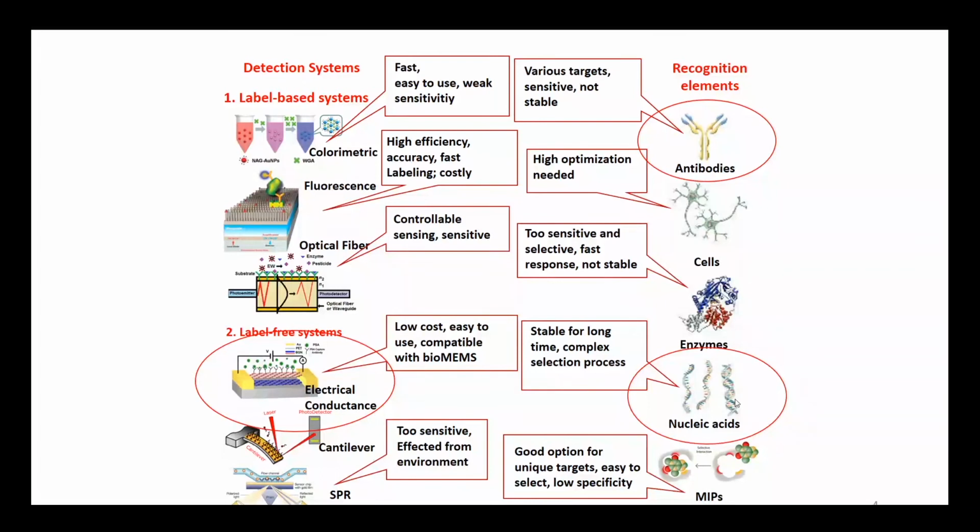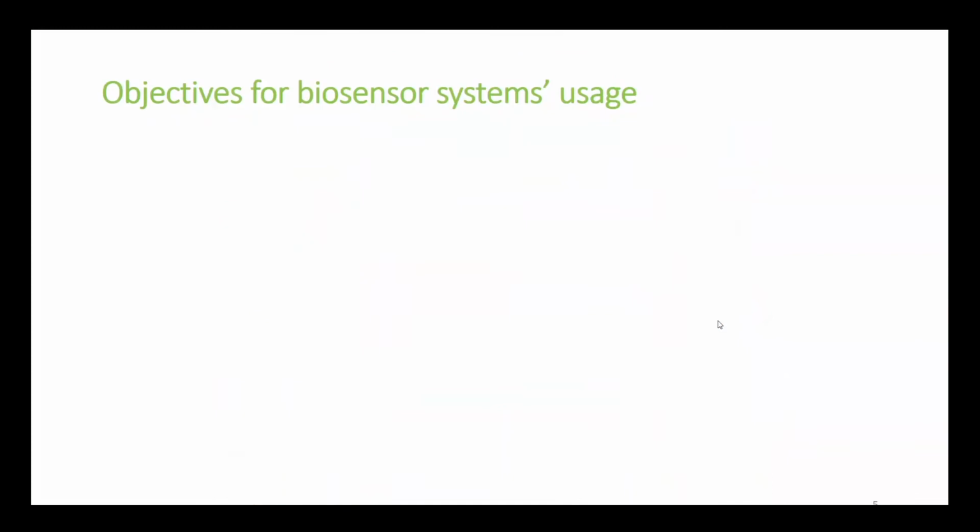But the nucleic acid-based biorecognition element is more stable than antibodies, because the nucleic acid, they're just quite stable. Even for 100 and 1,000 years, they cannot denature. So because of this, the nucleic acid-based biorecognition element has this kind of advantage over antibodies. So we would like to just test two of them to see their differences, their usability in this nano device.